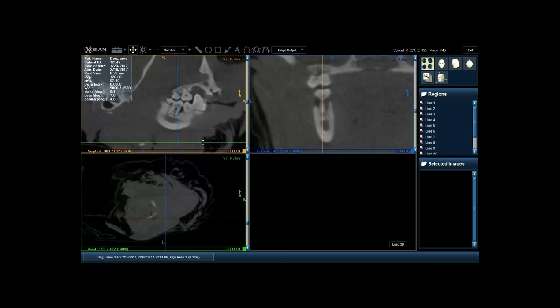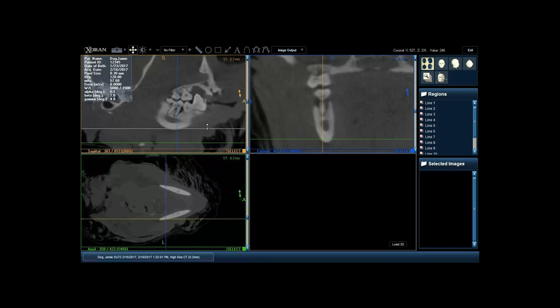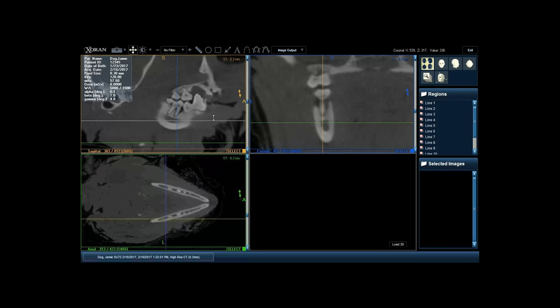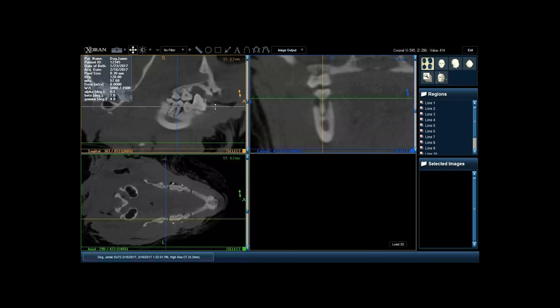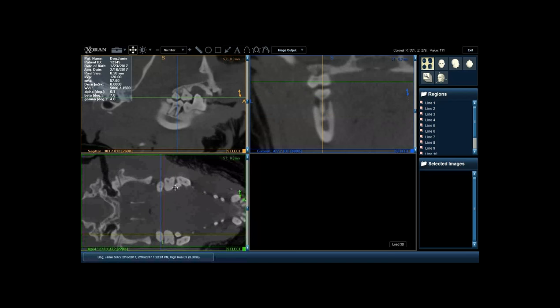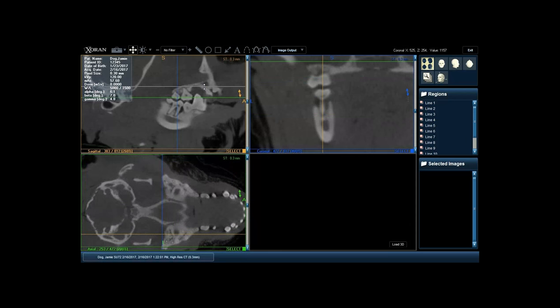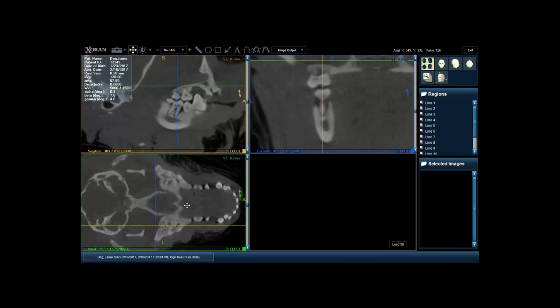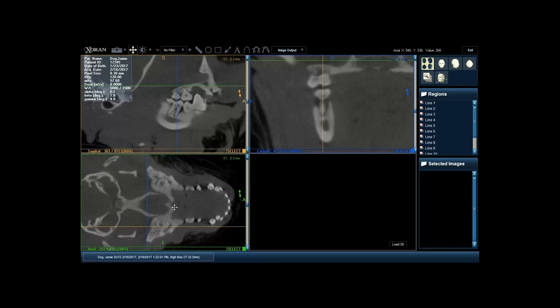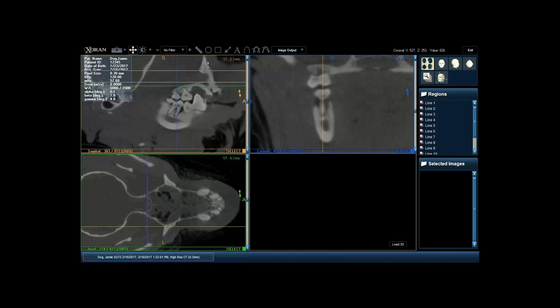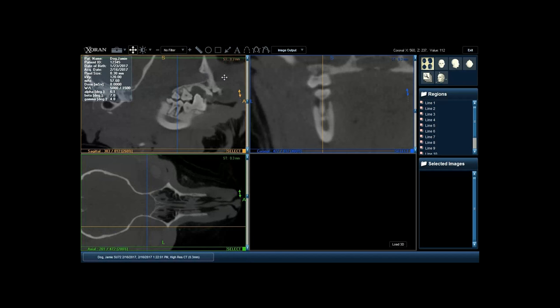Looking at the axial view — starting on the ventral border of the mandible and working up — we see the tooth roots appear, identify location and variation, and see where teeth from the mandible and maxilla come together. Endodontic lesions show up very nicely on axial views — you can see a lucency completely around the roots. And that's my systematic approach to reviewing Cone Beam CTs. After doing hundreds of these, I very quickly became capable of identifying abnormal findings, even on a quick preliminary scroll through.